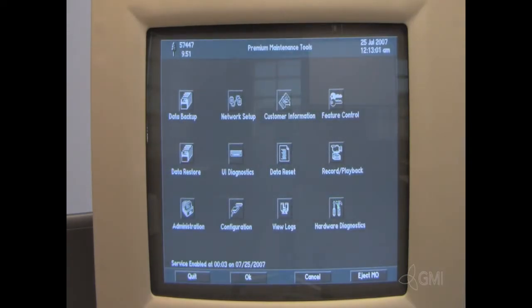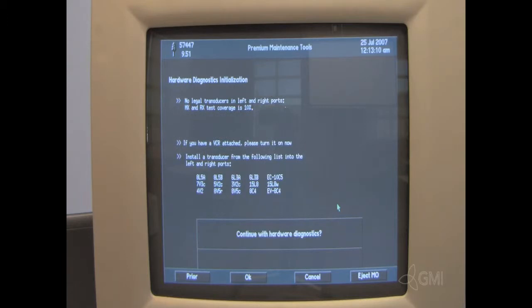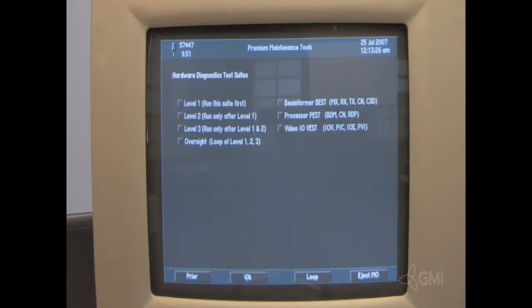Once the reboot is complete, select Hardware Diagnostics. Select OK to continue with Hardware Diagnostics. Select Test Suites. Then select OK. Level 1 must be run first, followed by Level 2 and Level 3. After choosing Level 1, select OK.